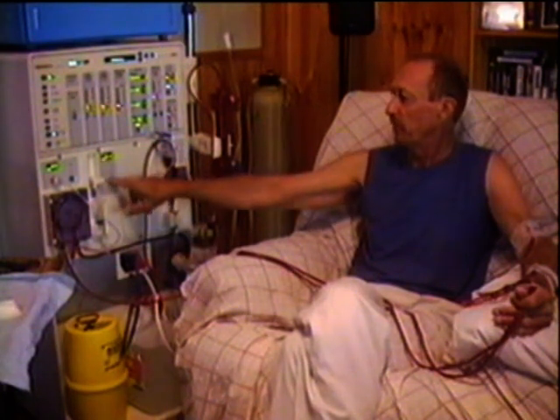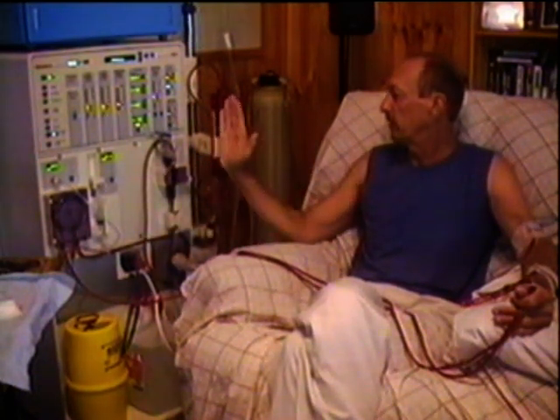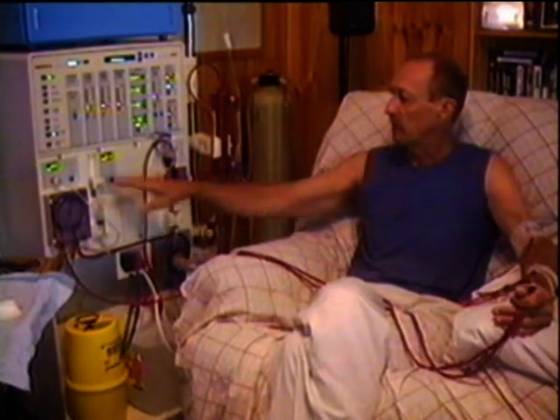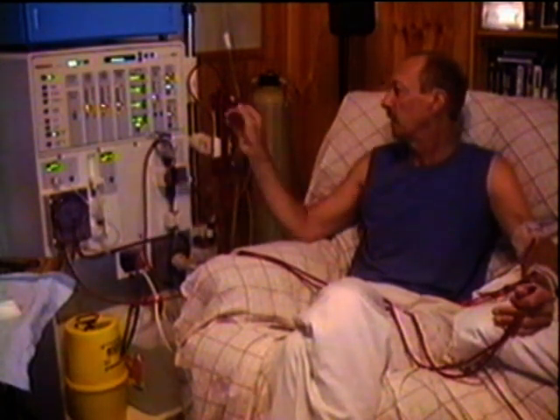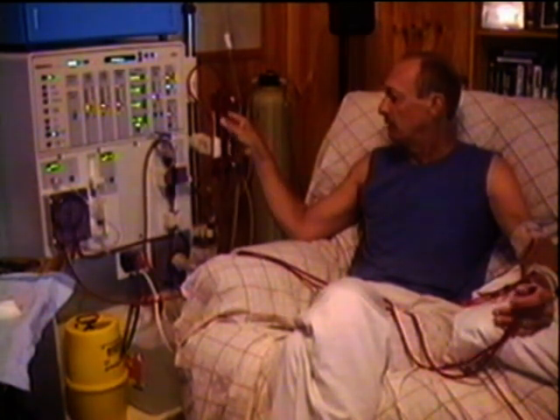Also we have to turn on the heparin pump. Over 4 hours that'll inject 1.4 mils of heparin into my blood, to stop it from clotting inside there and inside the kidney mainly — to stop any clots in the kidney. That's worked out during your training and as time goes by, how much you need — some people vary on how much they need. So now I'm away for 5 hours. I have to sit here for 5 hours. I record some shows late at night to watch during the day, read a book, set up a computer if you can. Or hopefully just wait for that phone to ring so you can get rid of this whole thing.